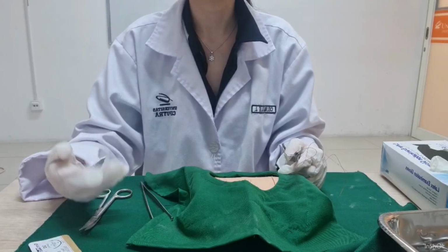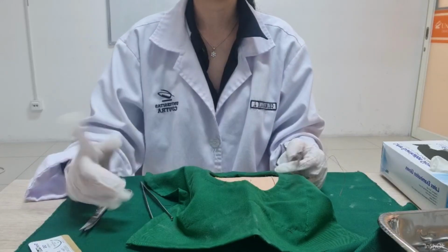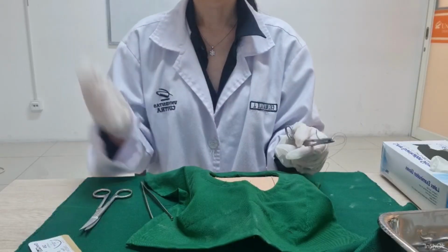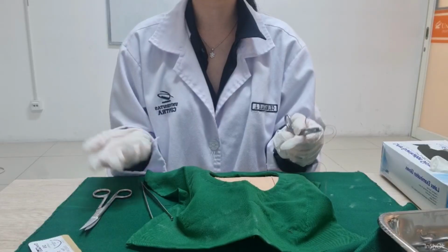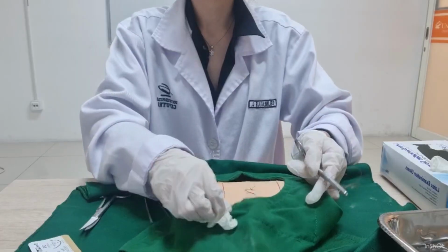And then I will do a series of simple sutures placed in succession without tying or cutting the suture material after passing through one knot. And the suture spacing and tension must be even throughout all the suture along the suture line. And after finishing at the end of the wound, I will tie the last knot at the suture line. And the knot is tied between the tail end of the thread coming out of the wound and the last suture. So I will begin now.